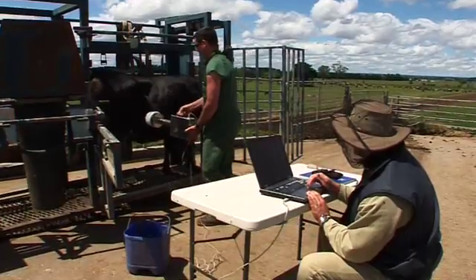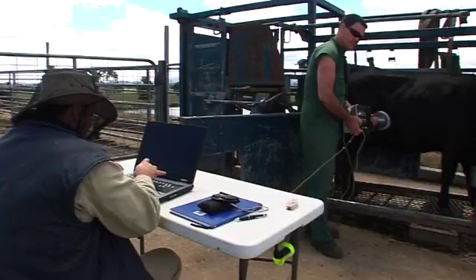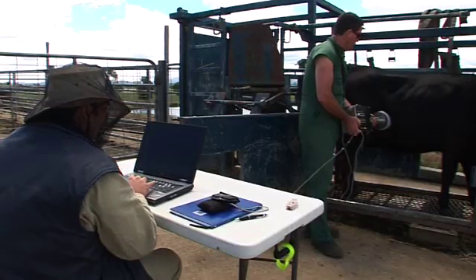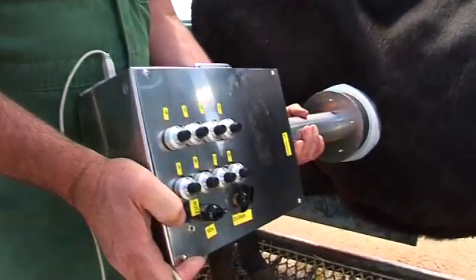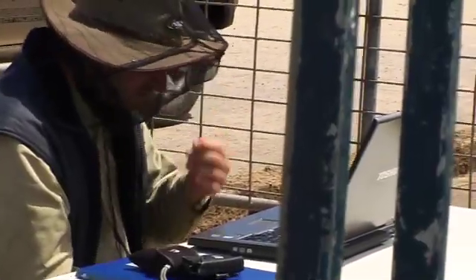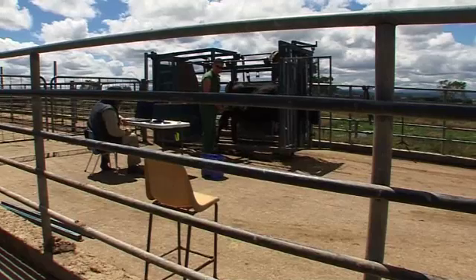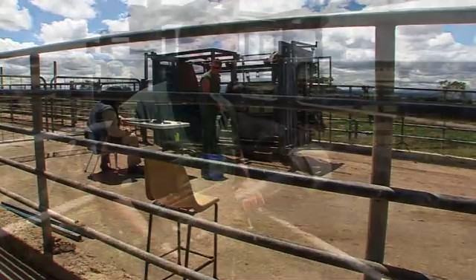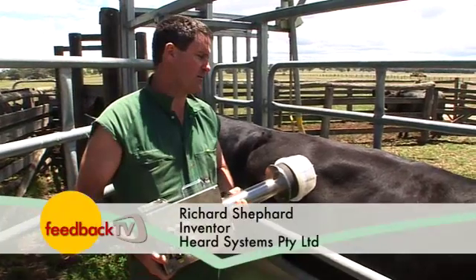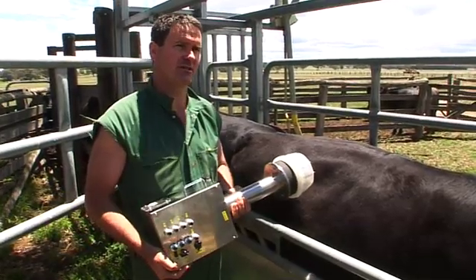It may look like a weird contraption, but this simple device could revolutionise pregnancy testing for cattle. It's a prototype portable scanner — easy enough for anyone to use, saves the cost of a vet, and operates externally so is safer. It has major advantages for all involved according to its inventor, a vet who's all too familiar with traditional methods. It's certainly non-invasive, so the cow doesn't get a sore backside, the vet doesn't get a sore arm, and hopefully the producer doesn't get a sore wallet.